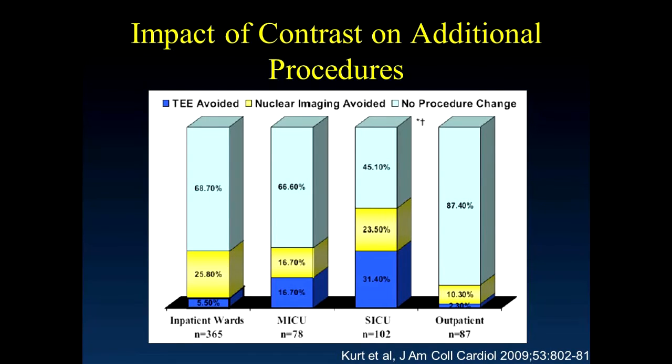Furthermore, Kurt et al. showed that contrast use is extremely cost-effective by reducing these additional procedures and decreasing downstream resource use. Contrast is actually incredibly cost-effective in these patients.